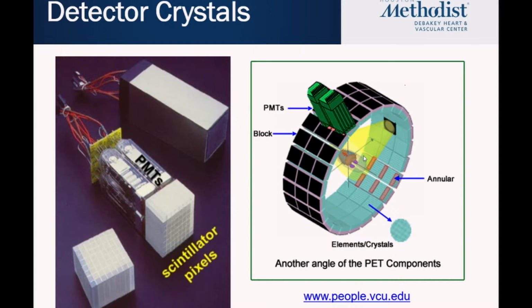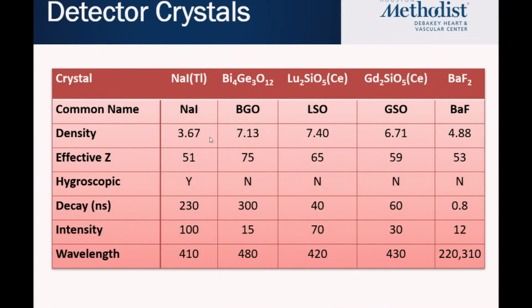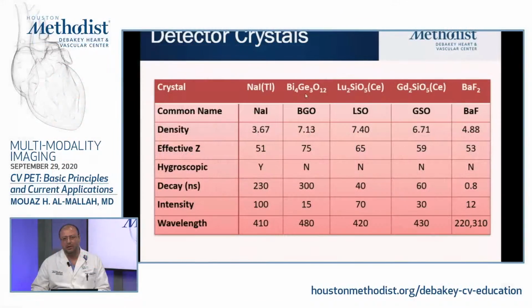The first thing that we're going to cover are the detectors, then we go ahead to the photomultiplier tubes. These are the different materials that we make our PET detectors from. The first one, which I put for comparison, is the SPECT one, which is mostly sodium iodide. Now there are solid state detectors or CZT, but they're not on this table. In PET, most of them are now using LSO, or the lutetium based.